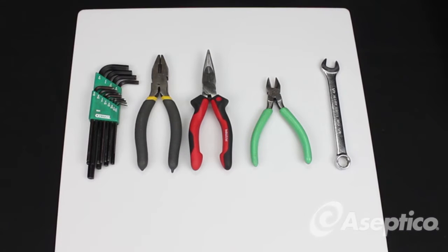Tools required: standard SAE Allen wrench, a couple of pliers, one needle nose, a wire cutter, and a half-inch wrench.